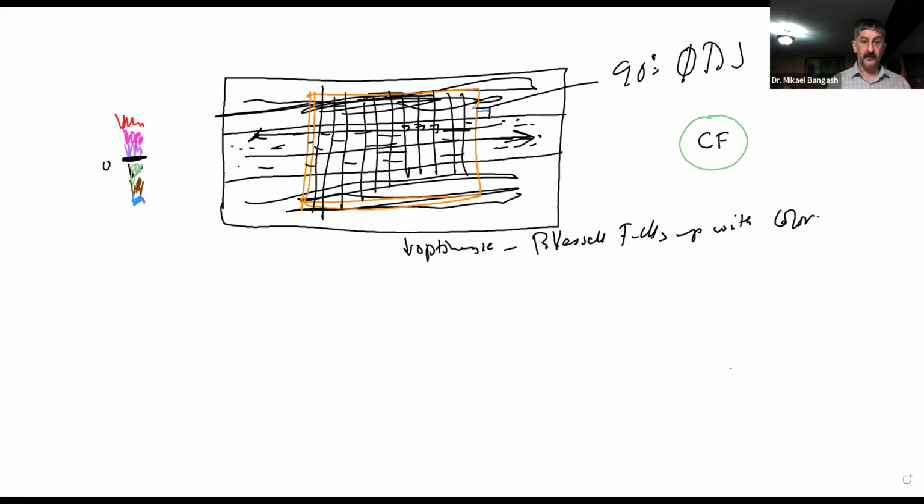Since the reason we don't see color is because of the 90-degree angle, we can steer the box to an angle other than 90 degrees. Did that make sense?